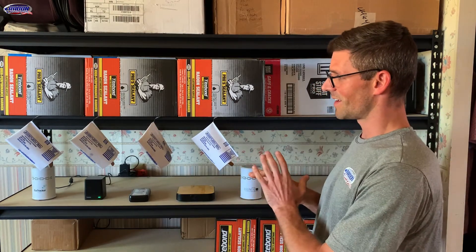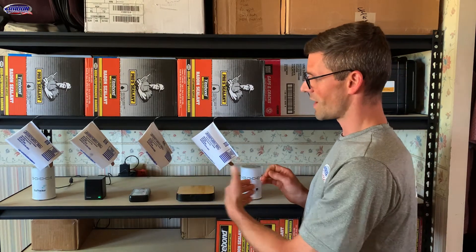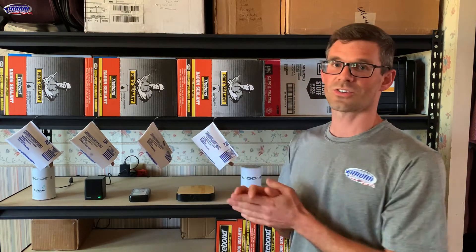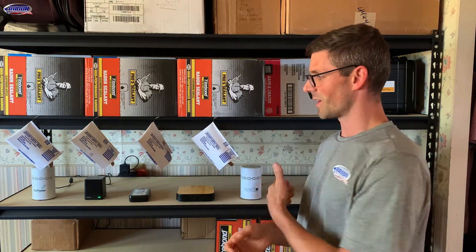What we've got set up here is a whole bunch of duplicate tests where all of our devices are about four inches apart from each other. I'm going to run this test for four days, then write down what all of my radon monitors are reading after that four-day test. I'm going to take two of these air check test kits and drop them in the mail, and the other two I'm going to UPS overnight to the lab, and we'll see how the results stack up against everything.